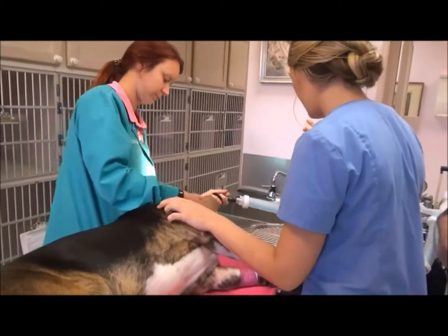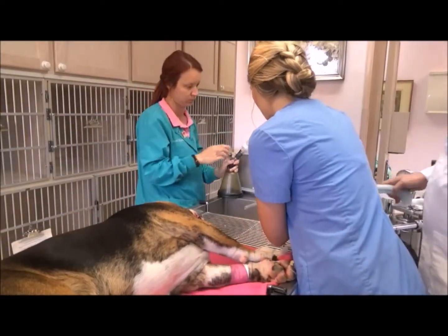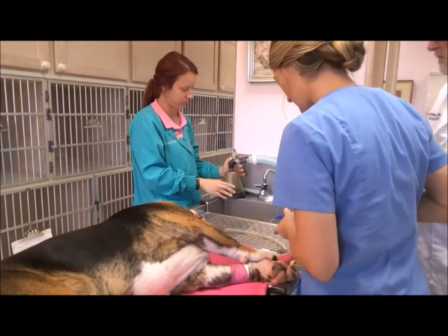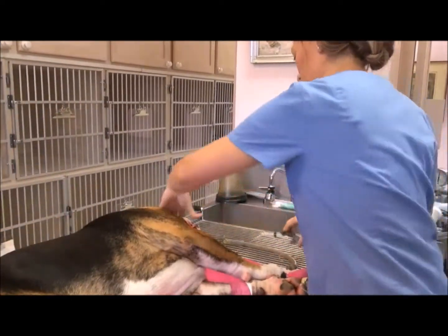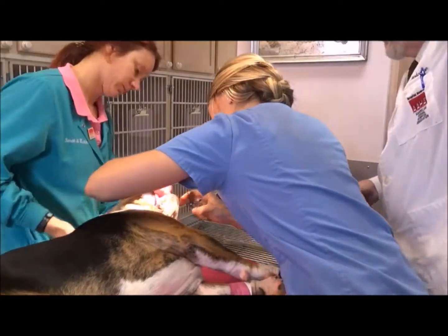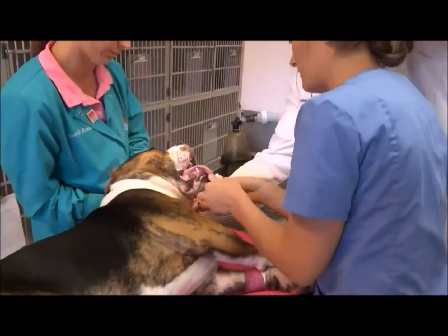So Sarah, I'll have you take the mask off. I'm going to test the pressure cuff real quick here. That's good. Okay. Place a mouth gag into the mouth here around the teeth. I'll have someone support under the head.